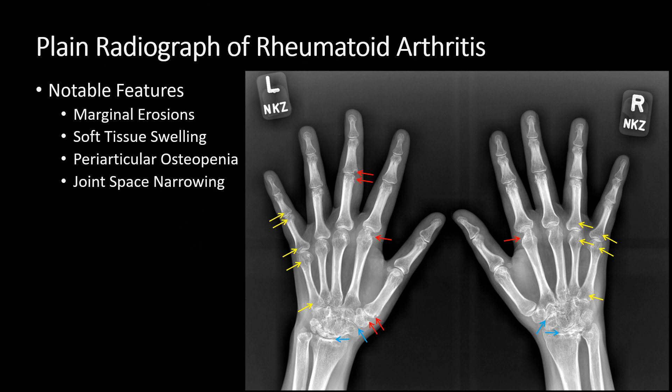Some notable features include marginal erosions, which are seen here with the red arrows. They look like little bites out of the bone on either side of the joints. Soft tissue swelling is also present — this patient has clear areas of mild soft tissue swelling surrounding the joints, particularly the MCP joints. The yellow arrows represent periarticular osteopenia.